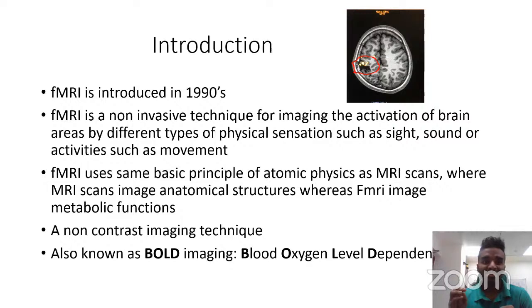So I repeat, since it's very important. We are engaged in an activity, currently tapping of the finger. When you tap your finger, the region which controls this activity is the precentral gyrus of your brain, which we have marked in red. That region is getting a high quantity of oxygenated fresh blood, that is oxyhemoglobin, which is diamagnetic. It comes in the vicinity of the main magnetic field, generates signal, and that signal we see as this yellowish activation. That is basically what we call metabolic function.